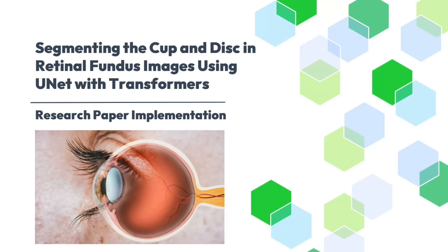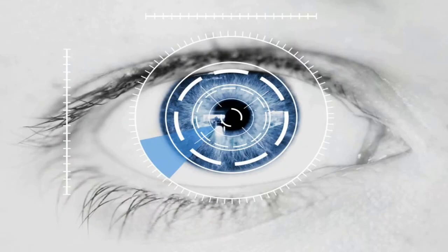In the fight against glaucoma, precision in analyzing retinal images is crucial. Today in this video, we are excited to explore research presented in the paper titled UNet Combining UNet and Transformer for Joint Optic Disc and Cup Segmentation and Glaucoma Detection by Rakshanda Hussain and Ritam Basak. So let's start with the problem statement.